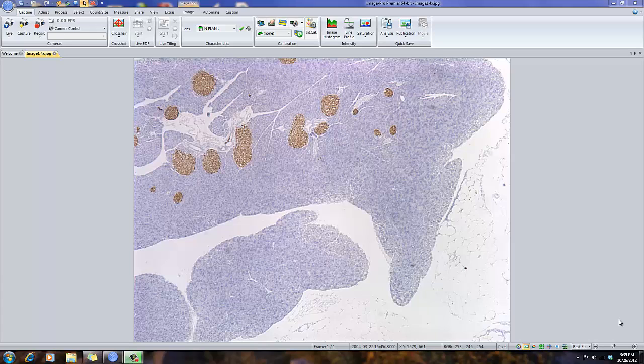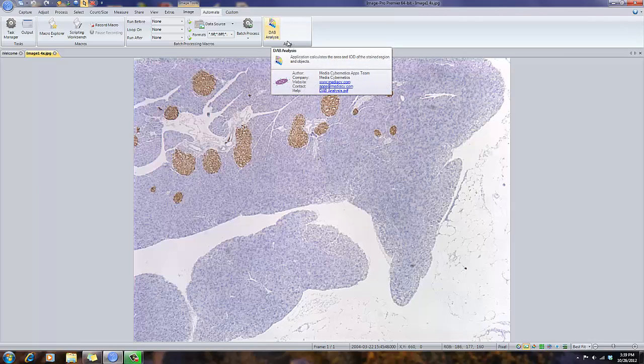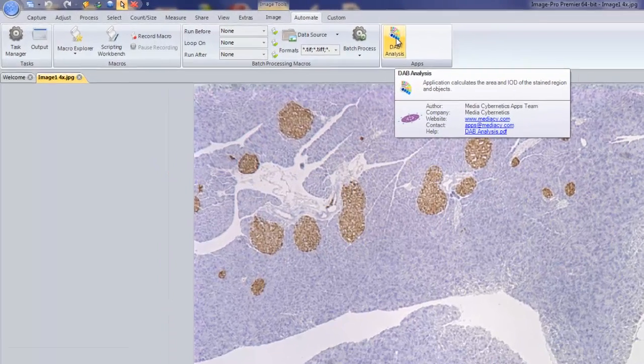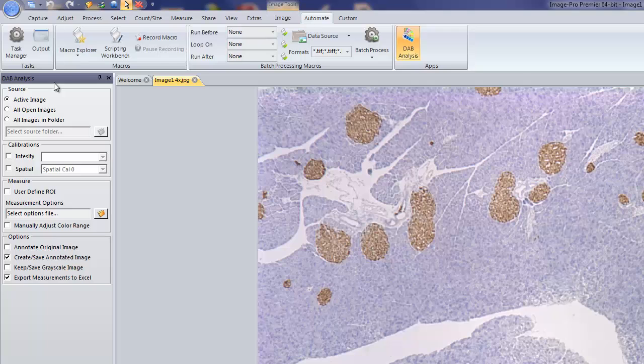To run the app, simply go to the Automate tab. In the Apps group, you'll see the various applications that you've loaded. In this case, I have the DAB analysis app. By selecting that, the DAB analysis toolbar will show up on the left-hand side of your desktop.